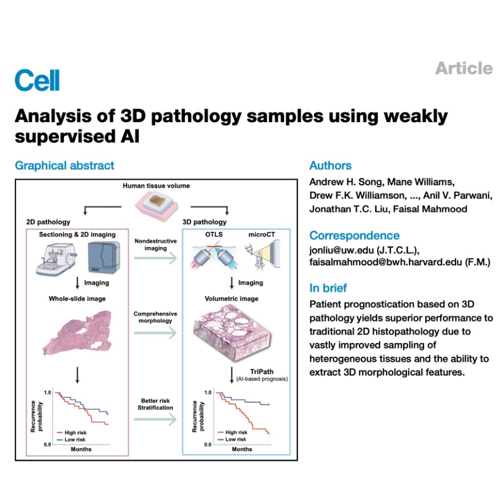And this wasn't just a fluke with the fancy high-res OTLS data. They repeated the analysis on the other cohort, the one using the lower resolution single-channel microCT imaging. Right, the less detailed 3D scans. Even there, the same pattern held.